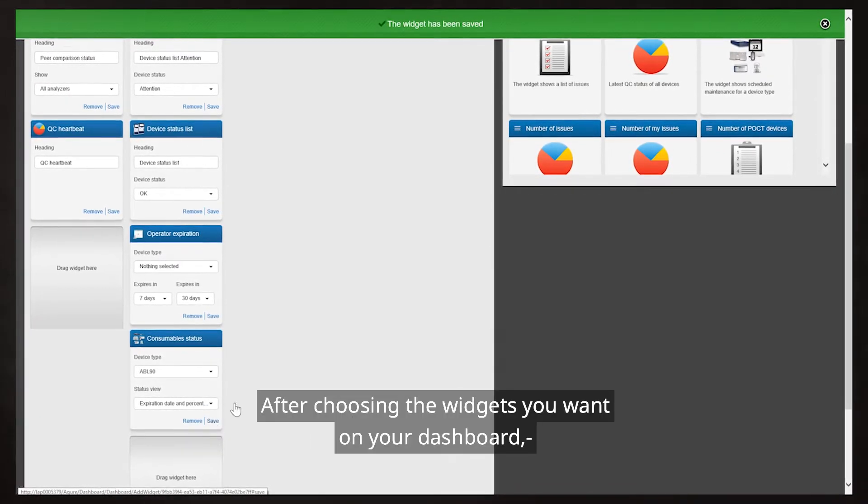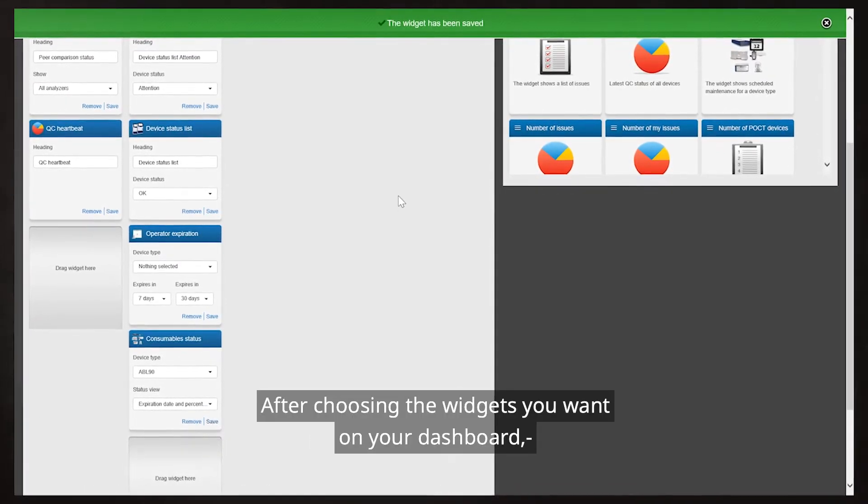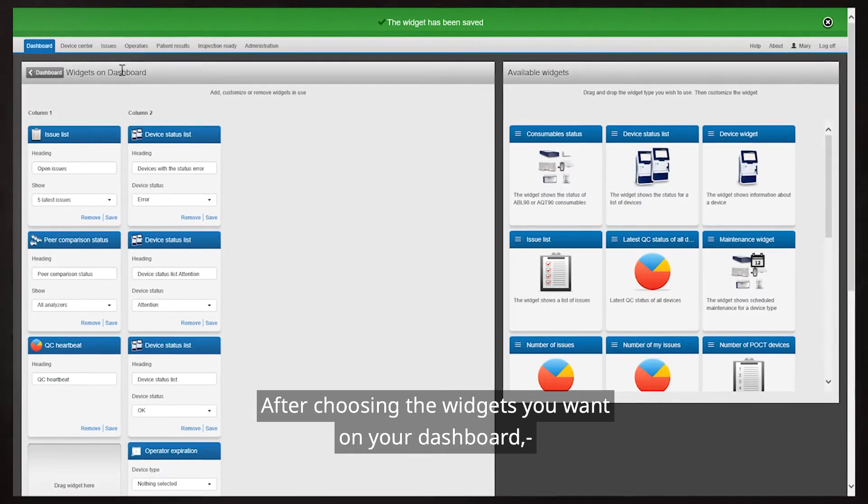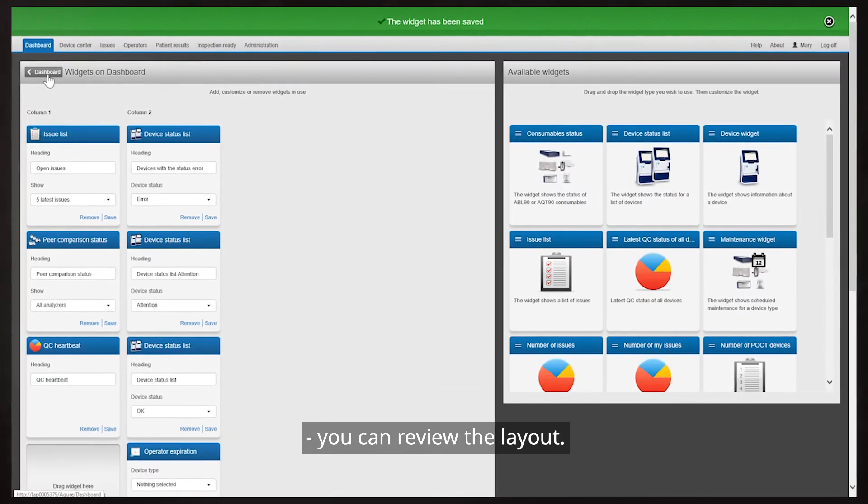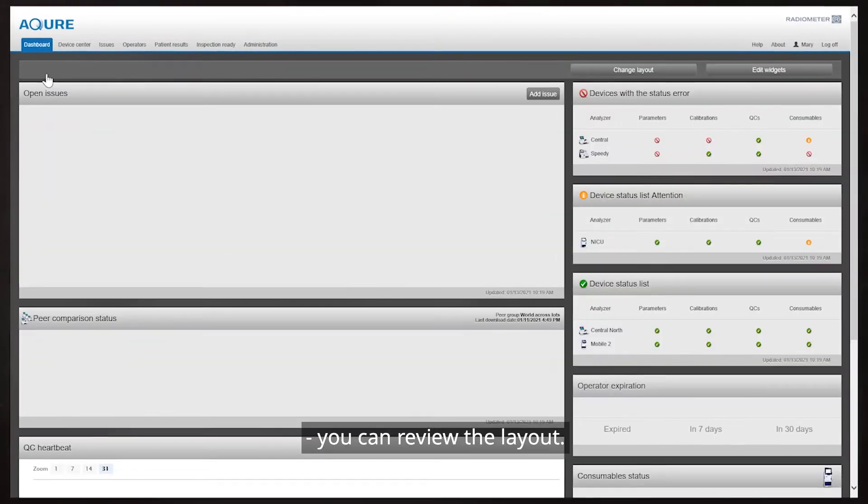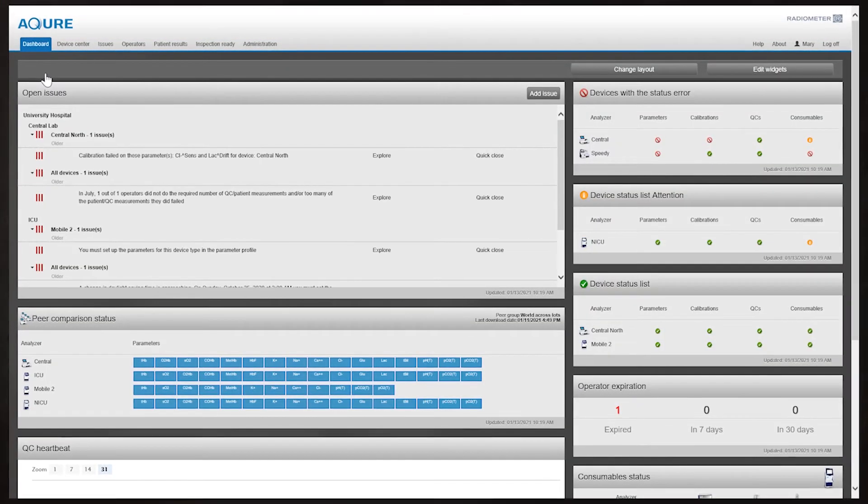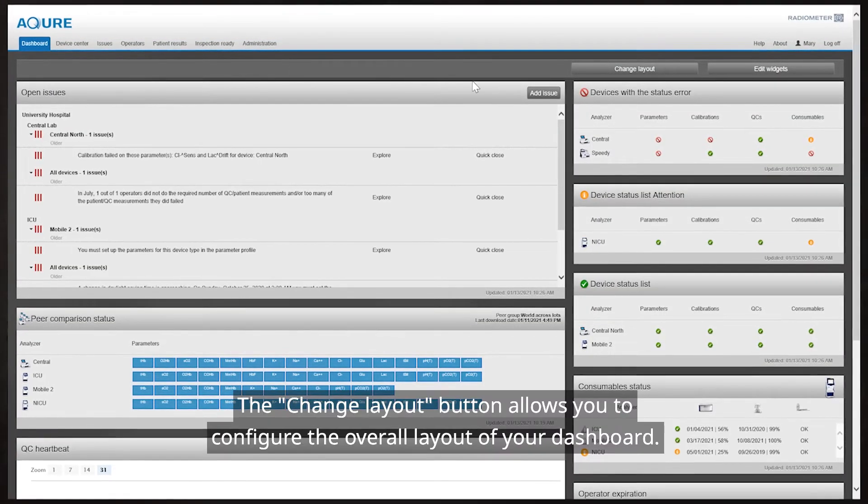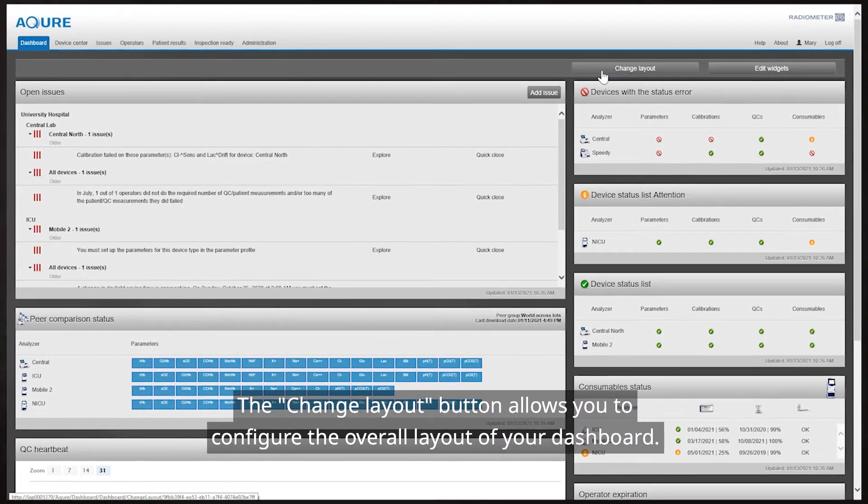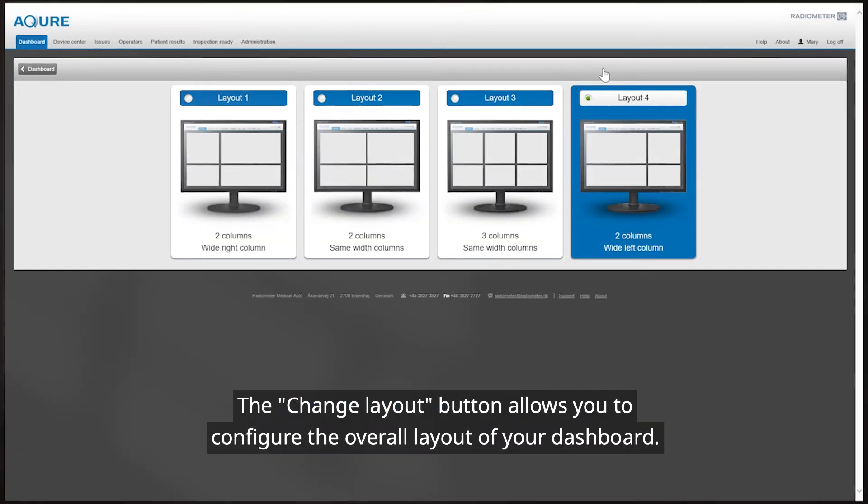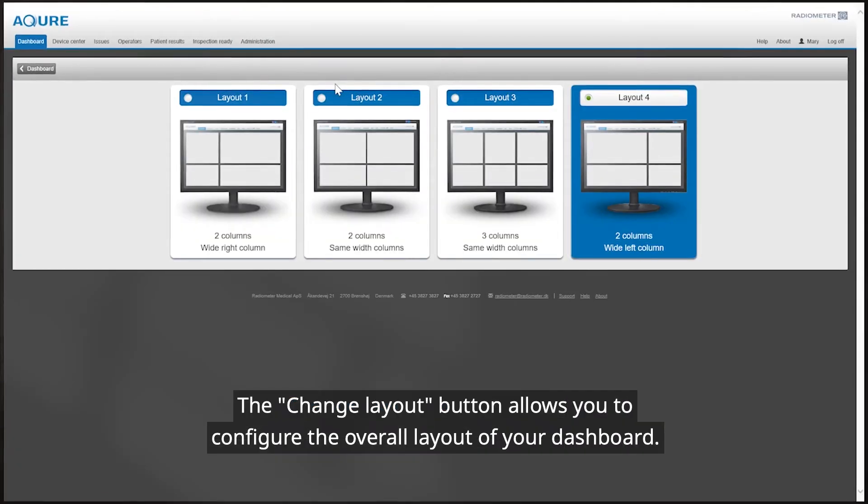After choosing the widgets you want on your dashboard, you can review the layout. The Change Layout button allows you to configure the overall layout of your dashboard.